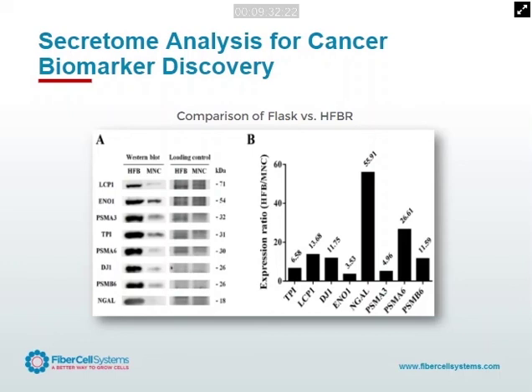So it's this cell culture environment that is causing these cells to behave more physiologically, because then they went back and started looking at serum concentrations of different proteins, and found that in point of fact, NGAL was extremely elevated in circulating plasma of the patients, and they wouldn't have picked this up if they were doing this in flask culture. So just another example of how profoundly cell culture conditions can affect the behavior and physiology of the cells.